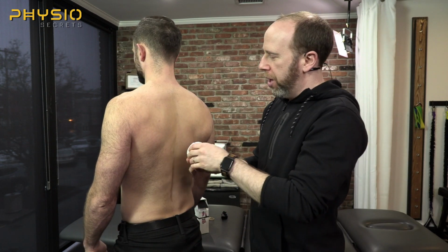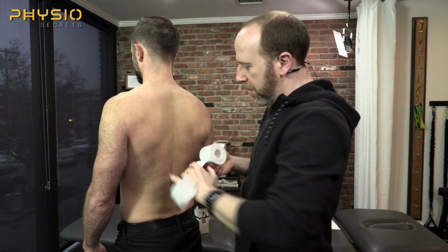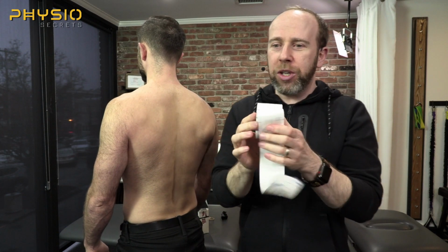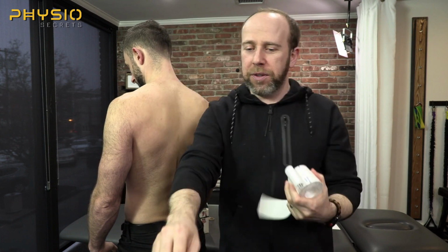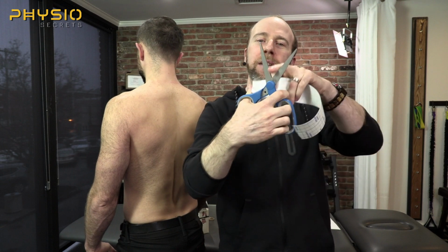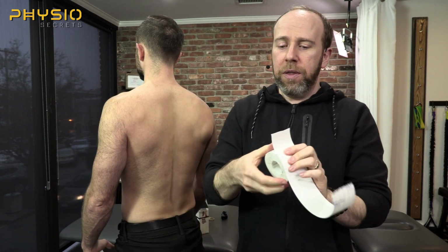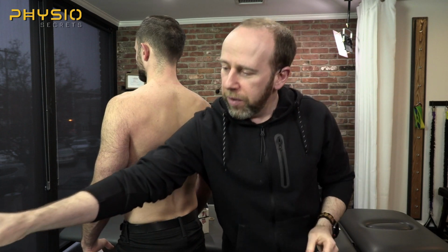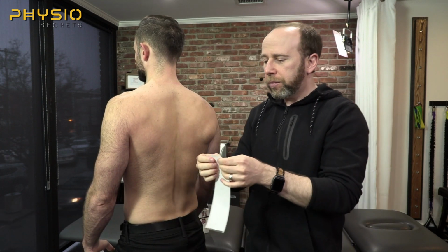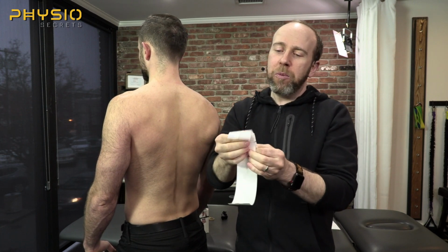I'm going to measure the same piece of tape from here down to about here, same distance. With cover roll, make sure you fold it backwards, so you've got this little loop, and then when you cut it, it cuts much easier. And make sure you cut in the base of your scissors, not the front of your scissors. If you cut in the base of your scissors, the glue from the tape doesn't come off. If you cut in the front of your scissors, it does. No need to trim the edges, although you could if you wanted to. And you don't break the tape, you peel the tape.